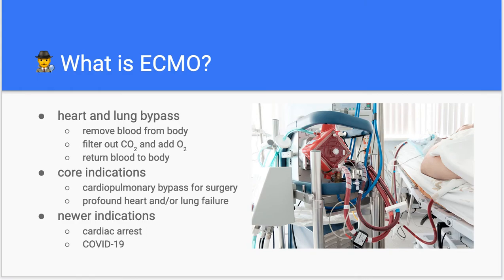The core indications are the main times it would be used. It's sometimes used during cardiopulmonary surgeries, like a heart transplant or something like that, where obviously there is no heart or there might not be any viable lungs for a few hours, so during surgery. And it's also used in patients that have profound heart or lung failure, systemic inflammatory responses, and sometimes now potentially it's getting used in some situations during cardiac arrest.